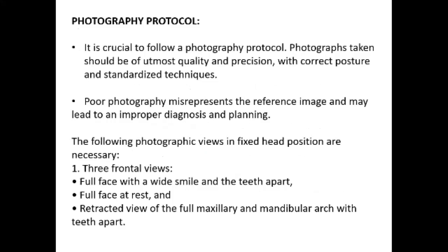Yeah. The photography protocol is very crucial, because if the measurements, the magnification ratios, and the photo quality are not precise, we might go wrong with the digital photography and digital smile design protocols. Poor photography misinterprets the reference image. When taken properly, this will give an excellent result, and it will help a long way in treating the patient. So these are the basic photographic protocols that are required.